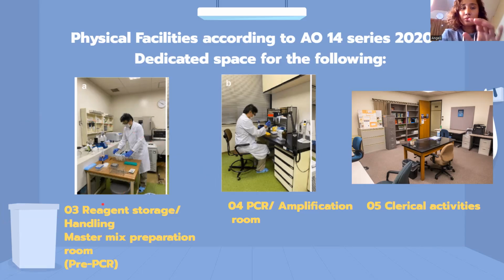So dapat itong reagent area, sobrang linis na, okay? There should be no contamination, okay? Any amplicons, ibig sabihin yung products of amplification, dapat wala dyan, okay? Kasi nga, if it's contaminated, then it will make your results inaccurate. So, negative pala talaga yung patient, dahil kasi sa contamination, naging false positive, di ba? So, dapat clean areas yung dalawang pre-PCR area natin, okay?